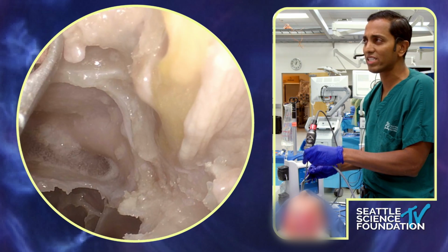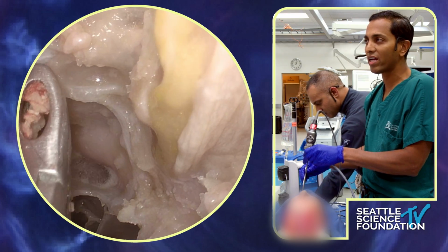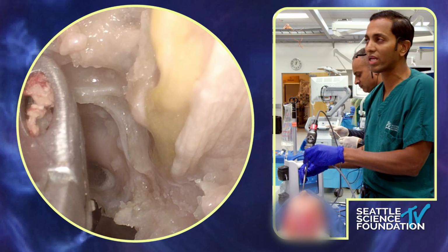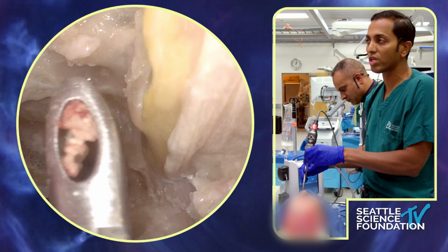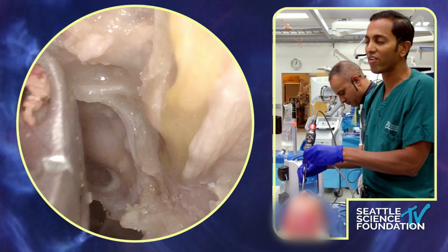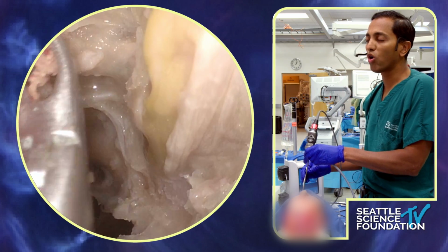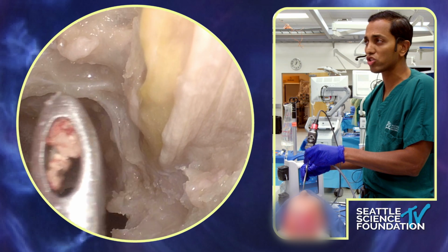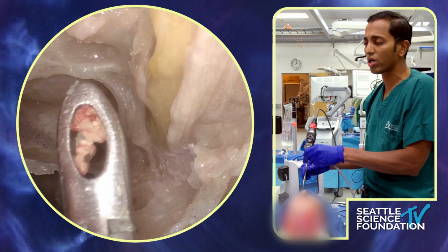As I told you before, I typically tend to use some sort of dural matrix. You could use fat that you can harvest anywhere from the belly. You can harvest it from essentially the post-auricular region, or you can get a little temporalis, fat and fascia, if you want as well. But you can use anything you want there. And then you want an overlay layer. As we talked about, in most scenarios, a nice free graft will work.